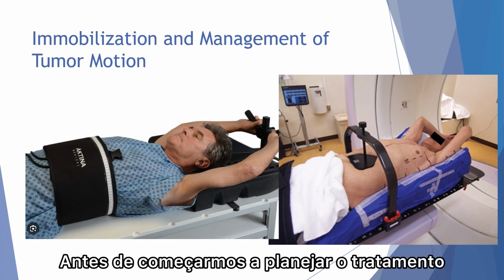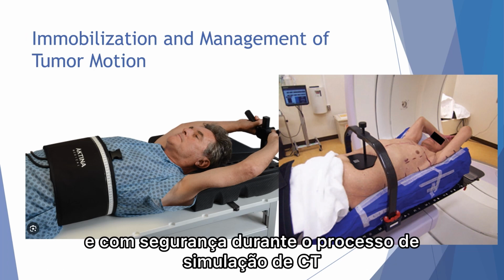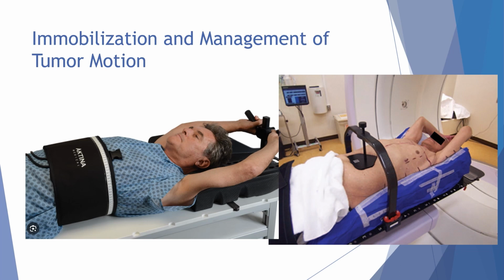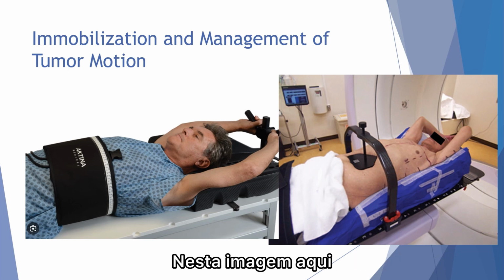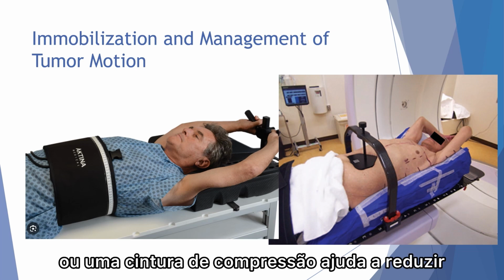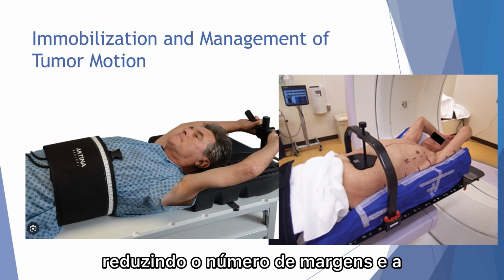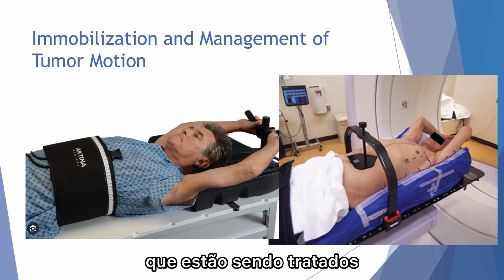Before we get into treatment planning, it is important to set up the patient properly and safely during the CT simulation process. For lung tumors, aids are used to help immobilize the patient. In this image here, a compression plate or a compression belt helps aid in reducing the tumor movement during respiration, thus reducing the margins needed and the organs at risk being treated.